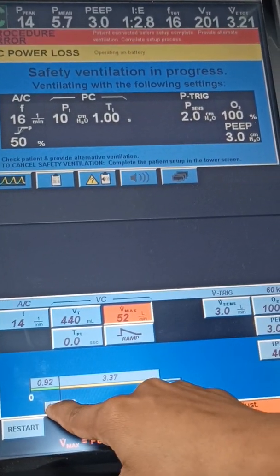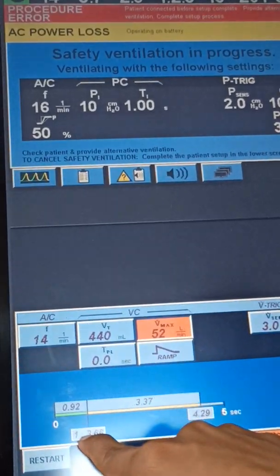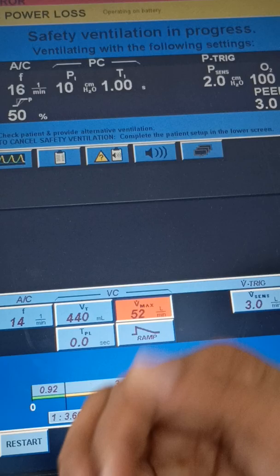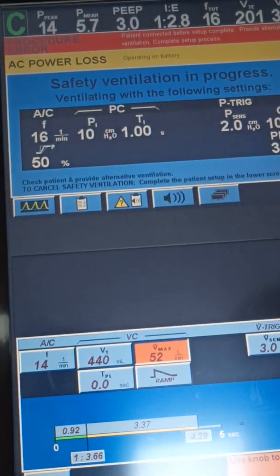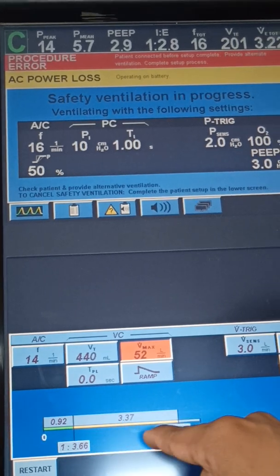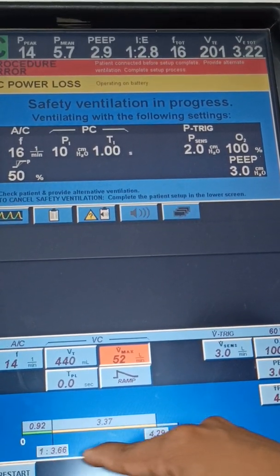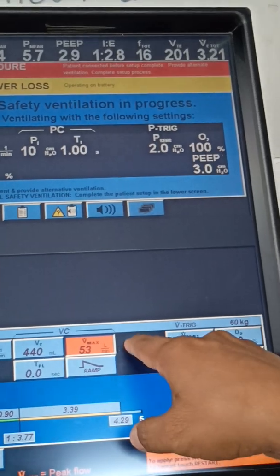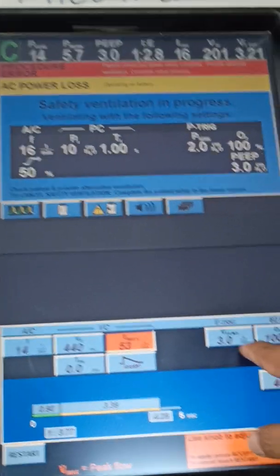Vmax depends on the I:E ratio. The I:E ratio here is 1:3. I:E ratio stands for inspiration-to-expiration ratio. Usually you will keep 1:2 or 1:3. If you change the I:E ratio, Vmax will also be changed accordingly.